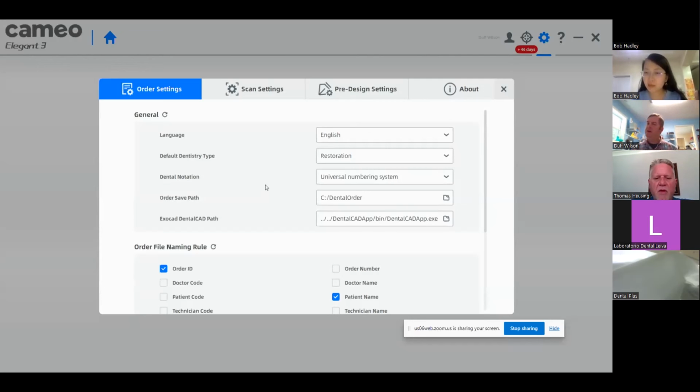I didn't realize how good the scanner was going to be when I started looking at it. The most important thing was that I wanted an open system that had no yearly fees. That's the main reason that opened my mind to it. Then I took a look at it and realized how good the daggone scanner is.